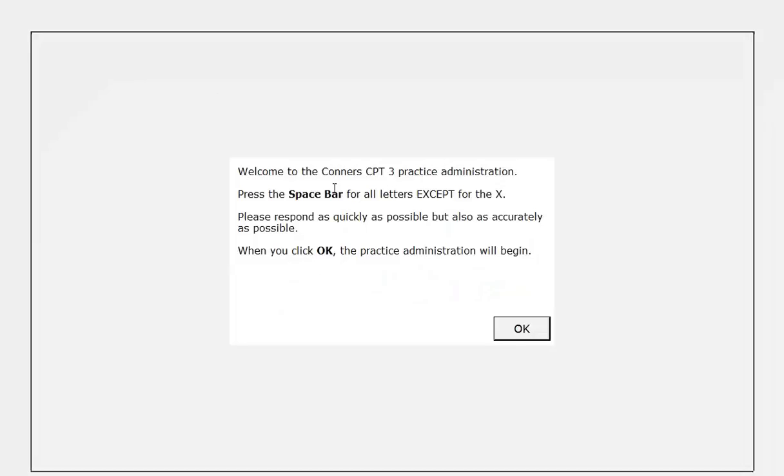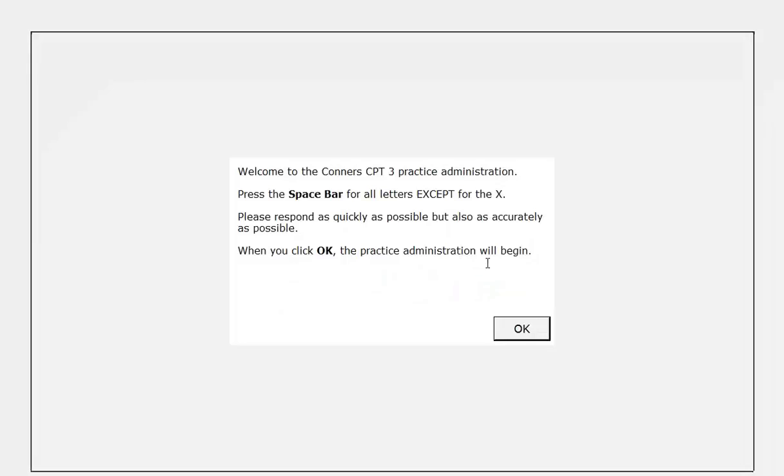Welcome to the Connors CPT-3 practice administration. Press the space bar for all letters except for the X. Please respond as quickly as possible, but also as accurately as possible. When you click OK, the practice administration will begin.